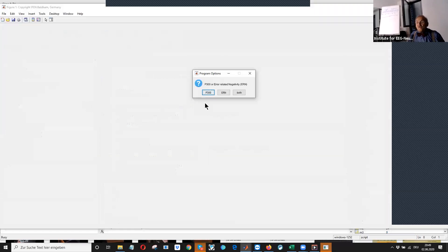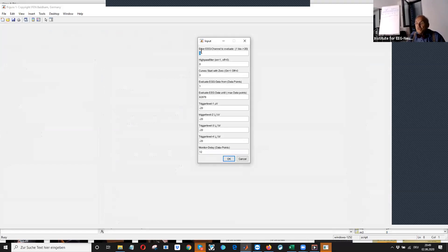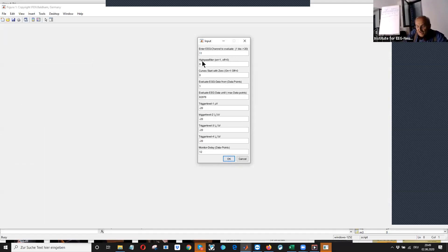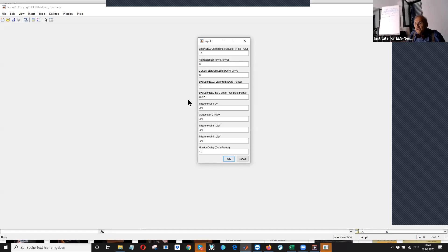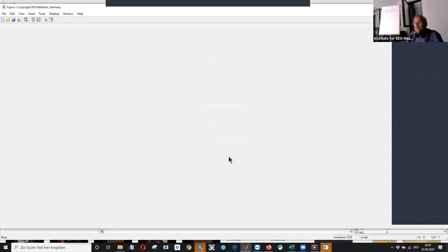You only have to say, okay, I want the P300, not an ERN. You select the channel, which channel you want to analyze. 18 was the channel for CZ, the central of the brain. And you should say run.